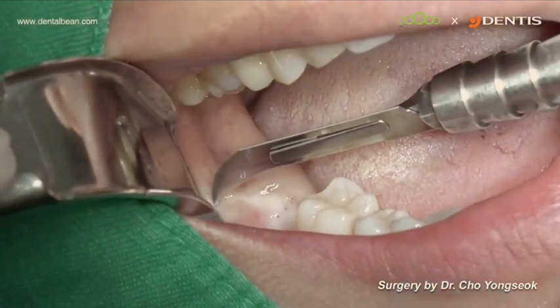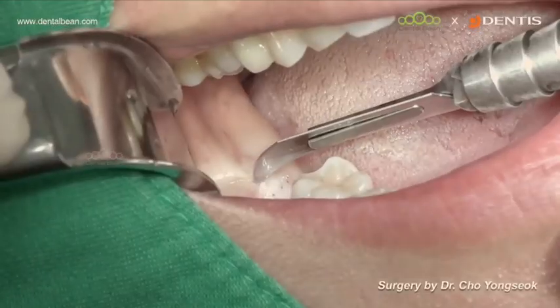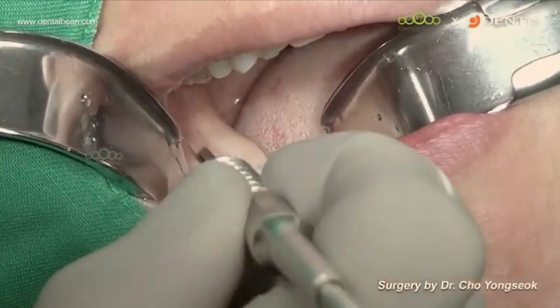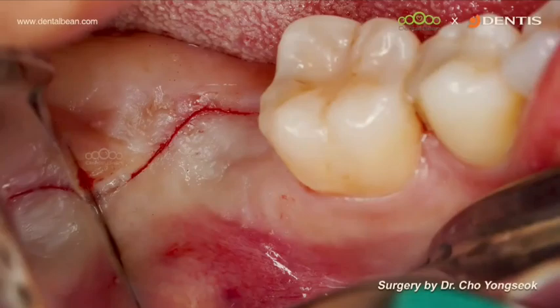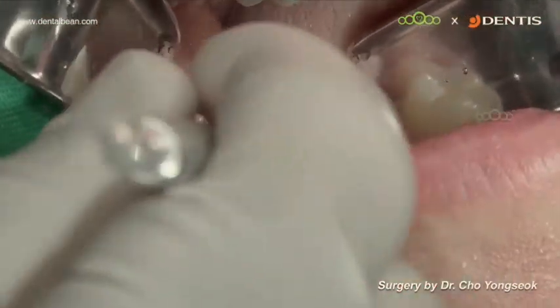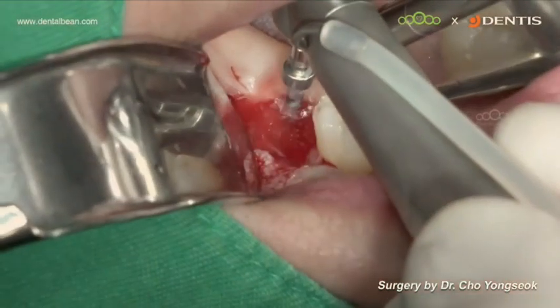Here you can see a buccal tissue defect. With the number 12 surgical blade, I made the flap. With the number 12 surgical blade, I can design the flap in one stroke. And I'm using a nice, fine periosteal elevator, the P24G periosteal elevator.